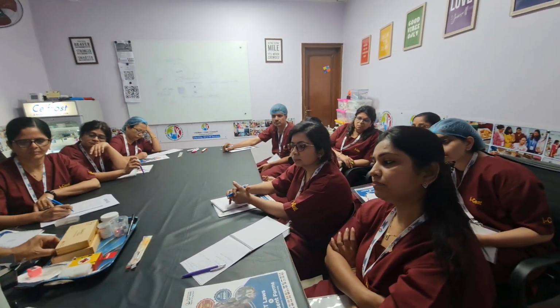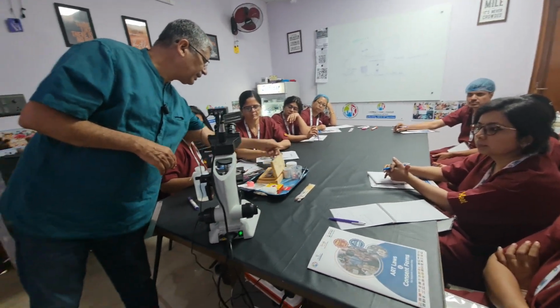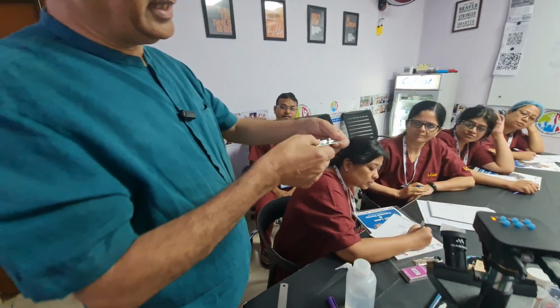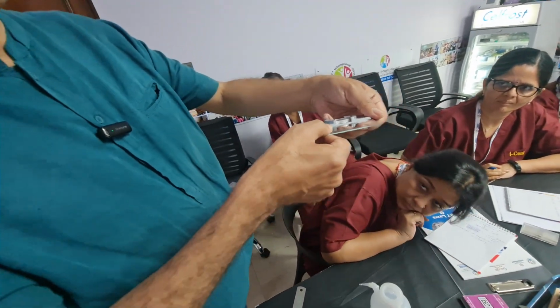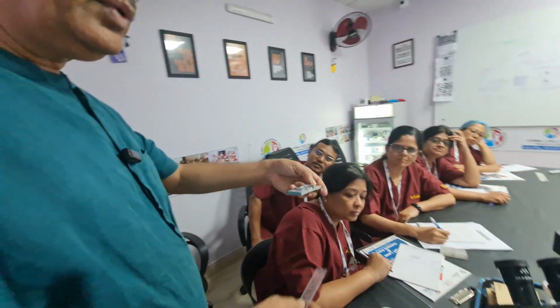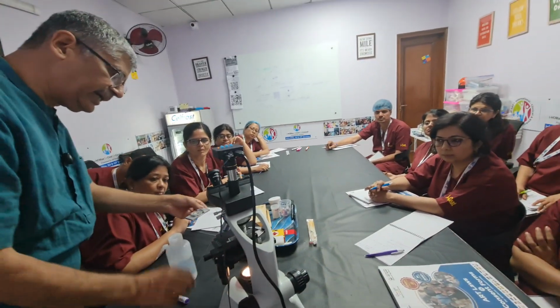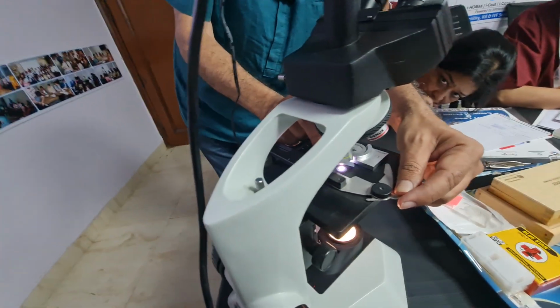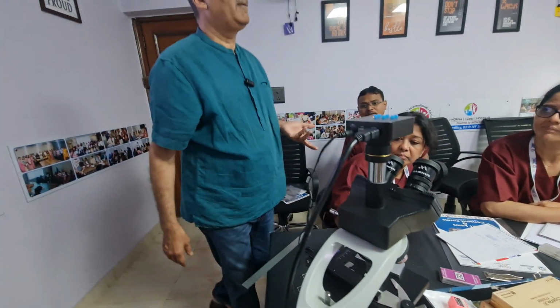Now let's look at a sperm counting chamber, and here I open one, an Indian brand. This is the Indian Makler, 30,000 rupees. Look at that difference of the height. We are looking at the height difference of the two things. This is around 4 times bigger than this, so it can't fit into this. Now in case I remove my slide from here and fit this inside, is it going inside? No. Why is it not going? Because it needs height.